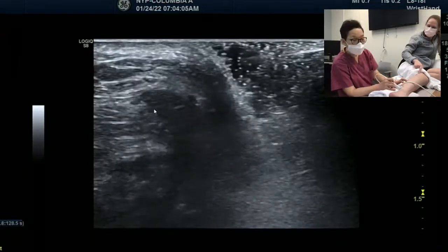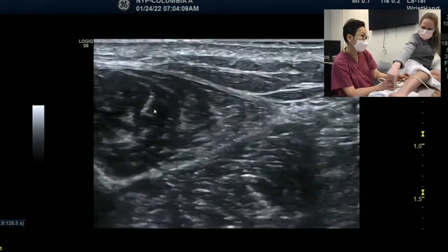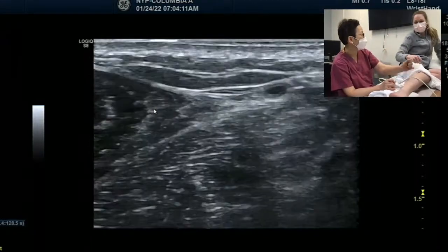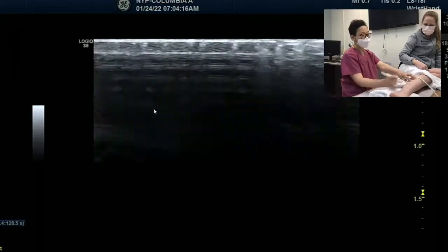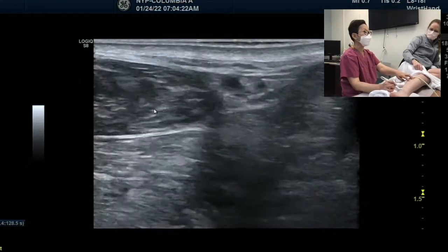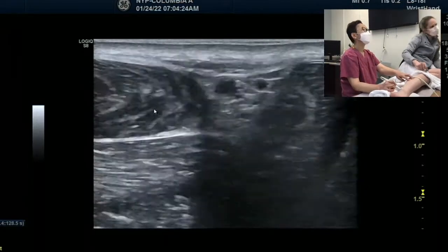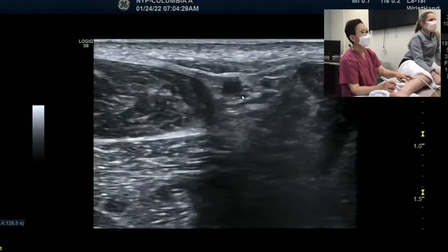But when you guys do EMG, you usually put your electrode, your probe, here, 14 centimeters from the lateral malleolus, to pick up the sural action potential, the stimulus. Right? So let's go to that area. So look at this. Where's the sural nerve? I see very well now. Excellent. David passed the test.